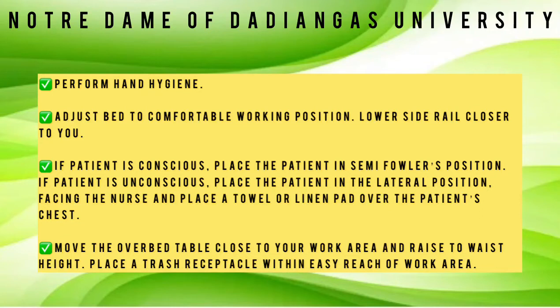Move the overbed table close to your work area and raise it to waist height. Place a trash receptacle within easy reach of the work area.